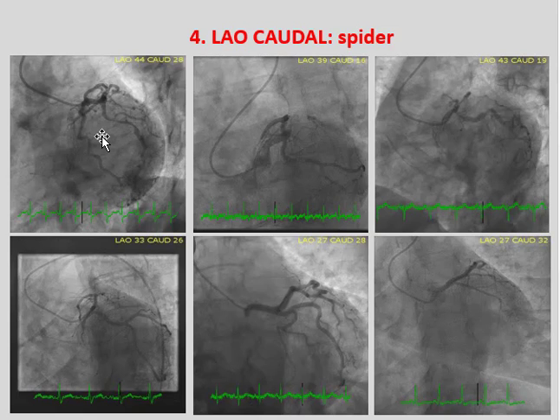It's called the spider view because imaginative cardiologists figured they could see a spider shape in here. Well, you can in some, particularly this one, maybe even that one and that one, and that one, starting to lose it in these two. But this is a view you just need to memorize because it is so unusual.